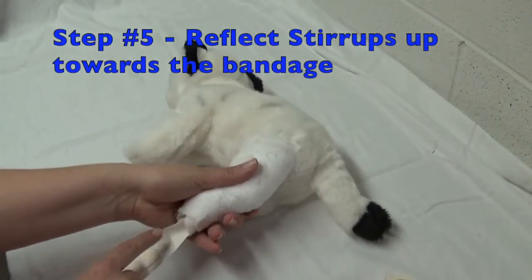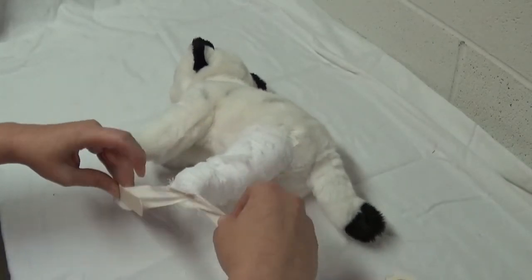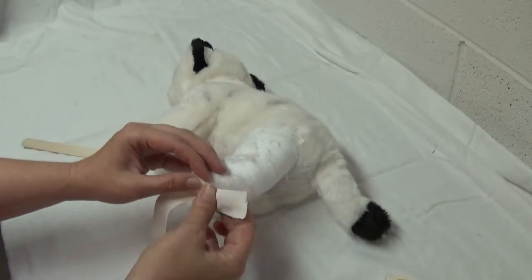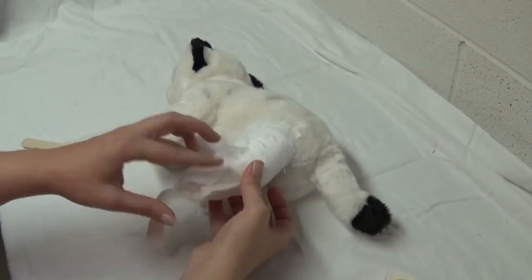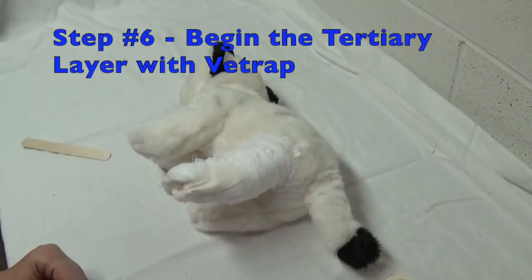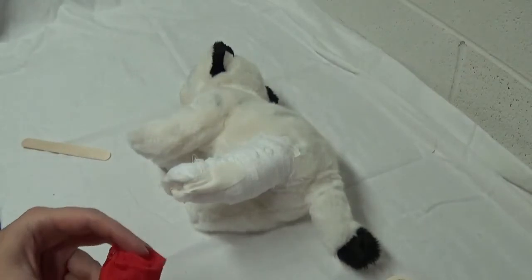At this point, you're going to take and reflect your stirrups back up towards the bandage — do a little spinny with the sticky side down. Now we're going to add the last layer, which is the tertiary layer: your Elasticon or Vet Wrap.